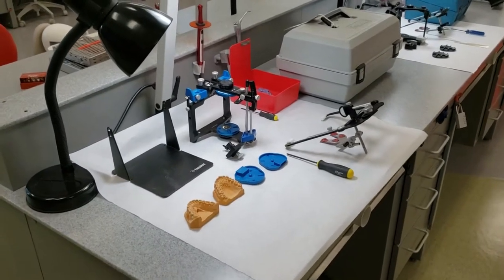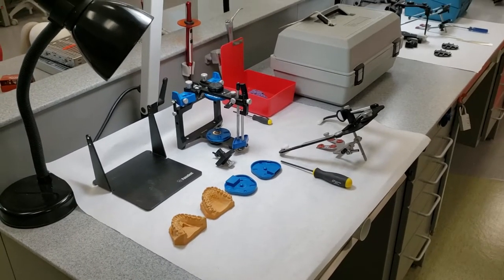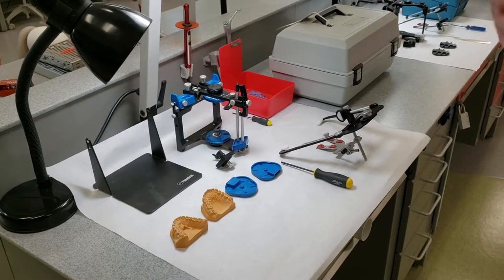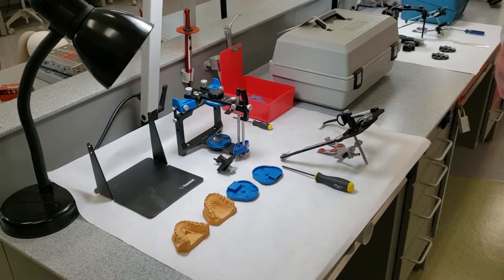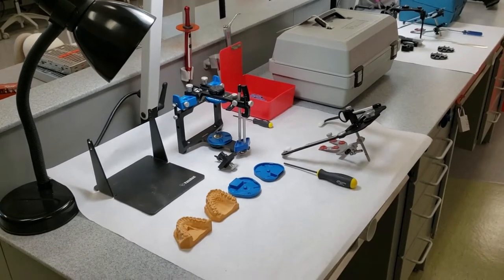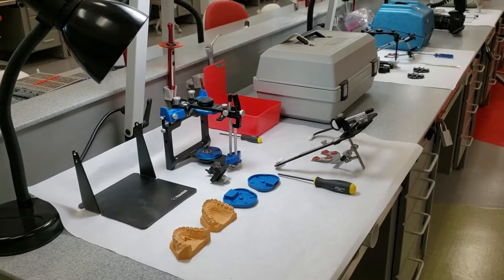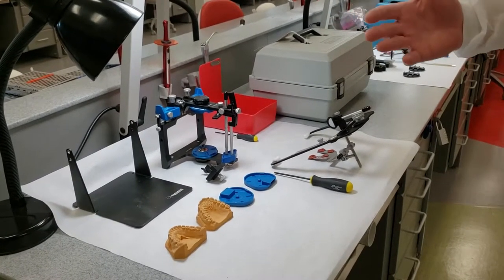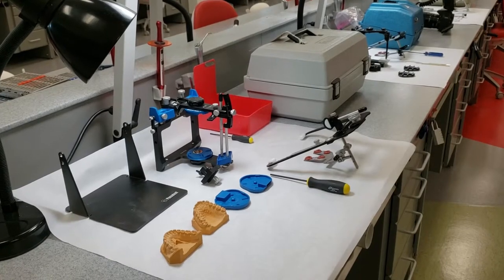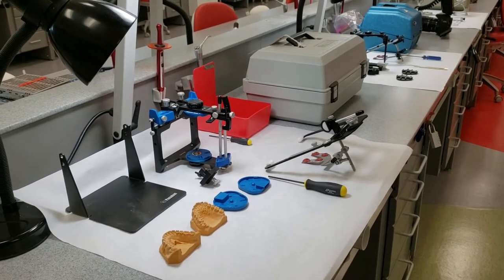Face bows or ear bows — there's nothing magical about them. They're just average value. They don't give us a precise hinge axis location. There are hinge axis locators, but they take 20-30 minutes for somebody that's really good at it. Using an average value ear bow or face bow gives us enough accuracy that it works, getting us close enough to that hinge axis that the work we do on the teeth turns out to be pretty darn accurate.